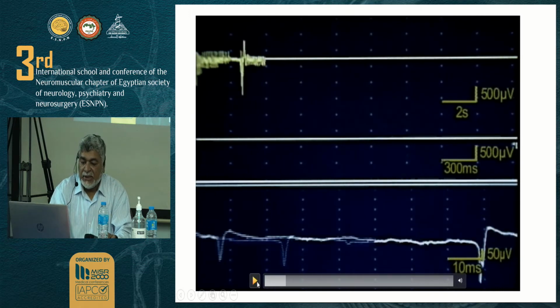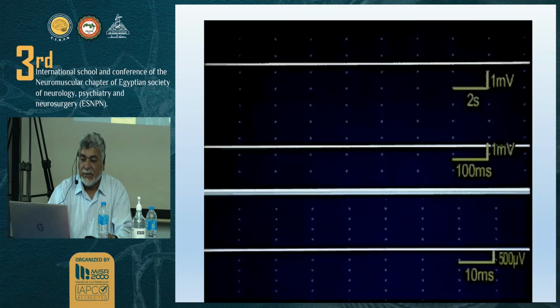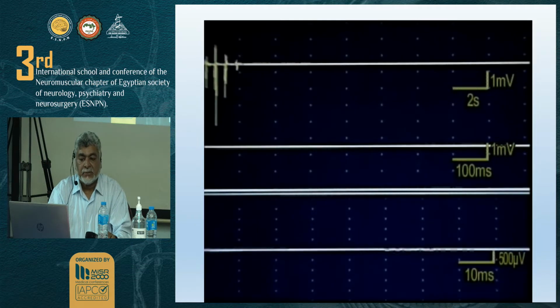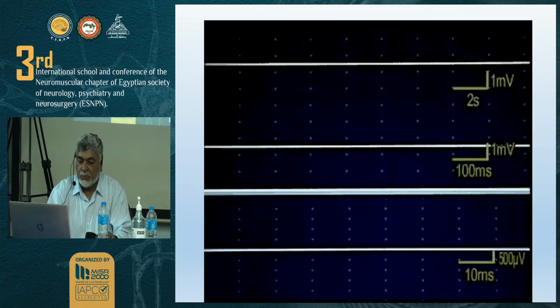Okay. So here's the insertional activity. Let me go back to my original slide. Here's the normal insertional activity. One more time. What you just saw was normal insertional activity. It would fire with each needle movement and then become quiet.